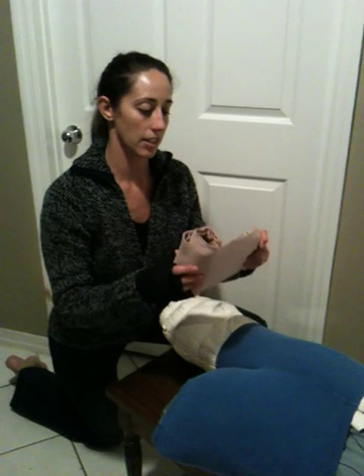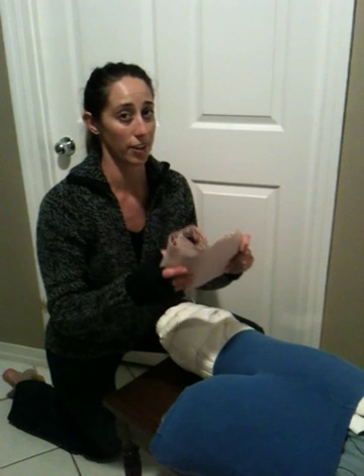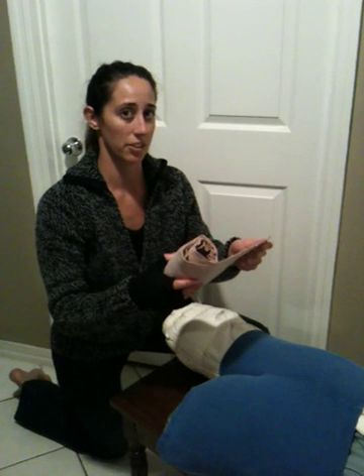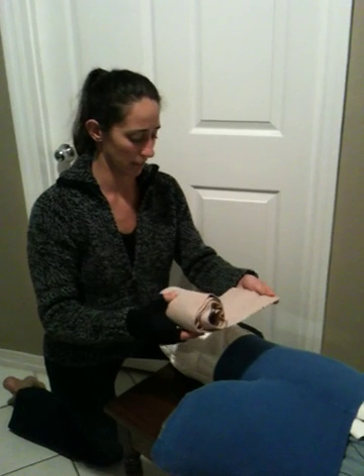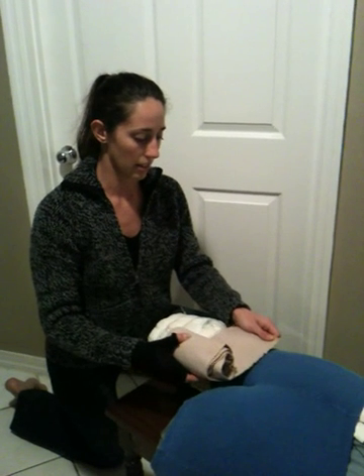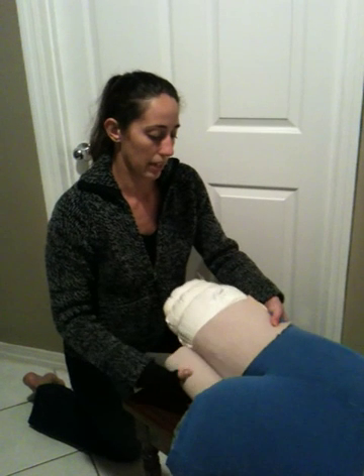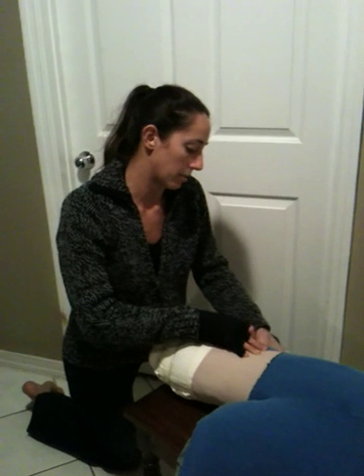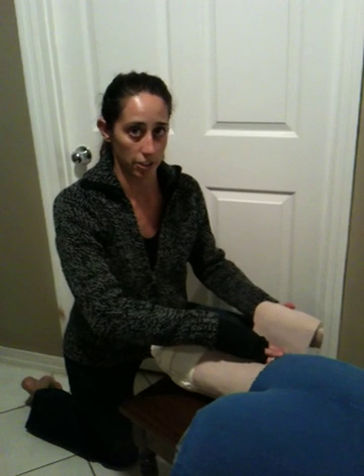You're going to see three different pieces of ACE wrap because they're not long enough. I'm starting off with a six-inch one because I needed extra space. The six-inch is actually going to cover a lot of this leg, so I wouldn't use a six-inch ACE wrap if my person were actually the right size. But as I saw in the YouTube video, the patella being covered was not an issue because it would just prevent the leg from developing any contractures.